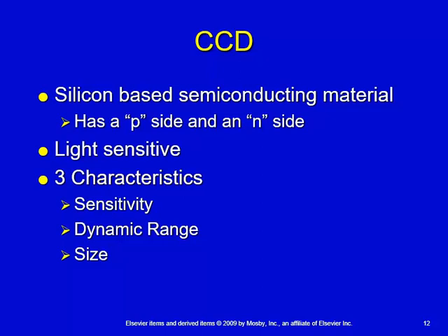So the way a silicon-based semiconductor works is if you apply negative charges to the P side, then the electron holes rush towards the negative, feeding into the P side, so that basically what you get is a dead zone between the P side and the N side. If you remember, we call that the PN junction, positive negative junction.